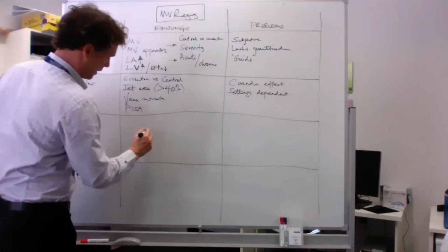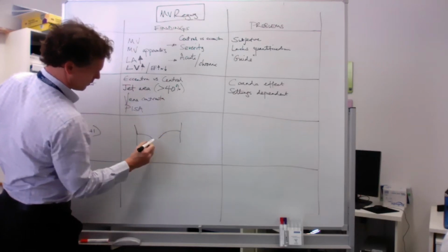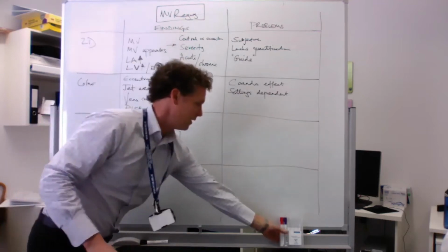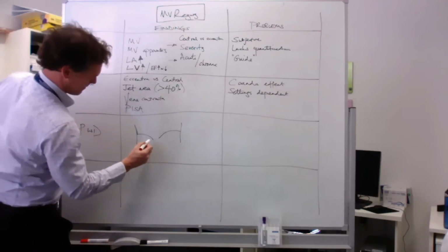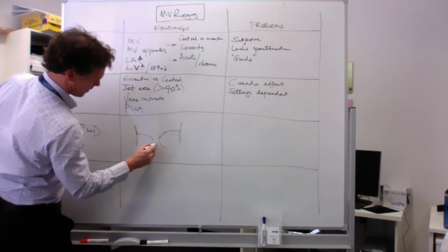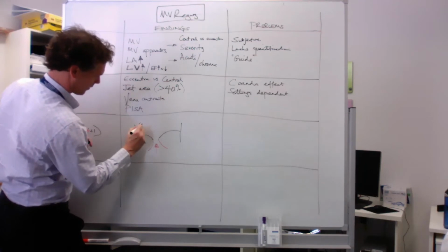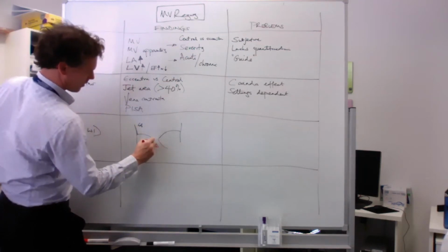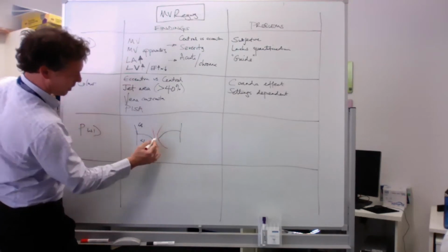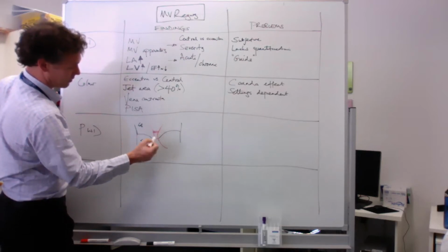So if you've got, so if there was a horrible, that's the mitral valve, and there's the left atrium, and there's the ventricle. See if I can choose a better color. As the flow comes in, back from the LV, it should accelerate to the narrowest part. Yeah, nice. So the narrowest part is not actually as you go through there. It's actually a little bit distal to it, to the regurgitation area.